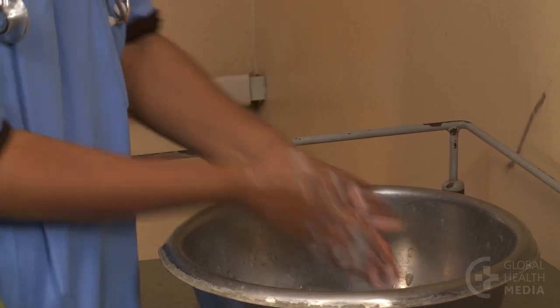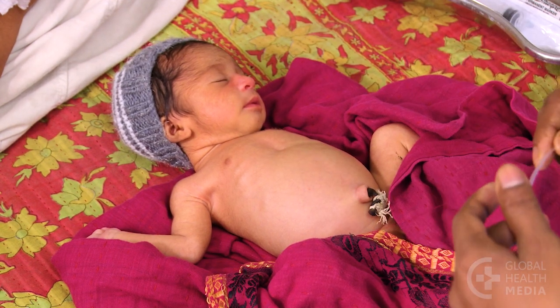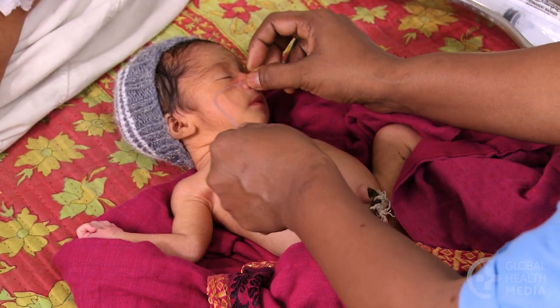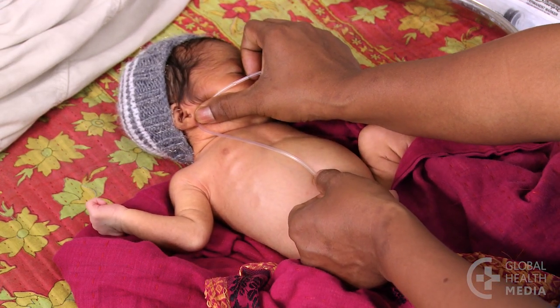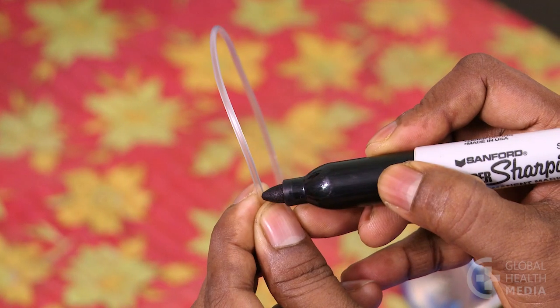Now wash your hands and put on gloves. Next, measure the length of tube to be inserted. It goes from the tip of the nose to the earlobe, to a point halfway between the tip of the breastbone and the umbilicus. Put the end of the tube on the tip of the baby's nose, stretch it to the earlobe, then to a point halfway between the tip of the breastbone and the umbilicus. Mark the length.